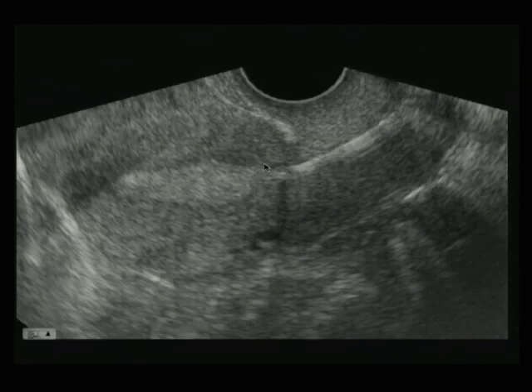Here's another IUD, which is actually bent within the fundus of the uterus in a peculiar orientation. We really don't know, using 2D ultrasound, what the real position of the IUD is. Here's a patient that has a low-lying IUD. You can see the IUD is down in the lower uterine segment or cervix.